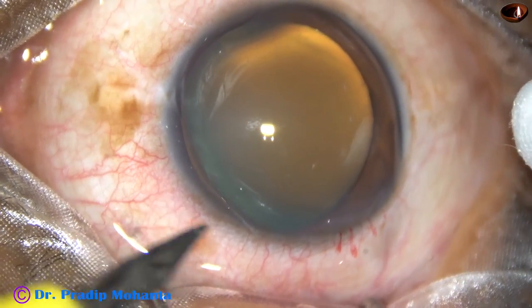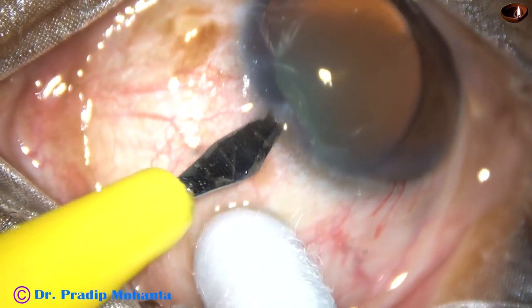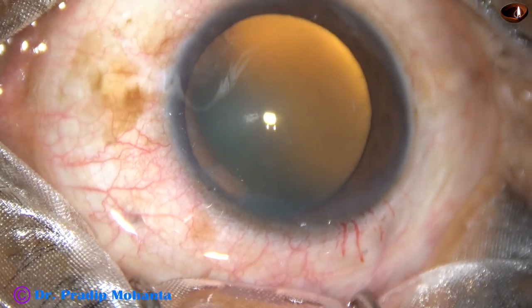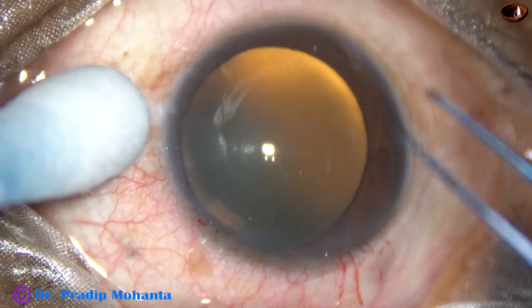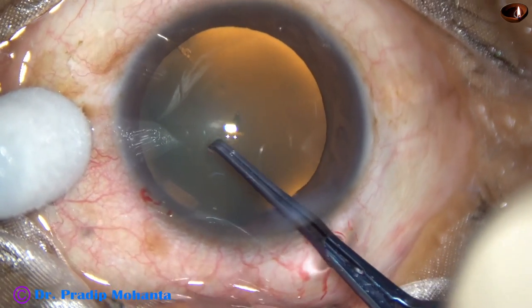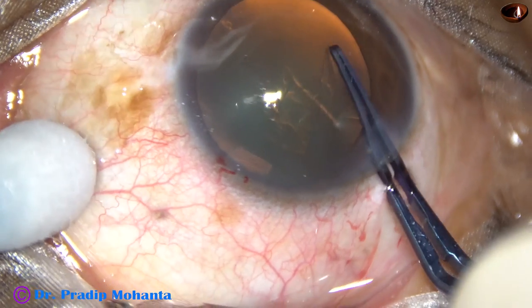By this time, the main incision has been made. Visco has been injected into the anterior chamber and applied over the cornea. A side port has been made. And now, capsulorhexis — I am using the Utrata forceps, raising a flap by the forceps itself and doing this.